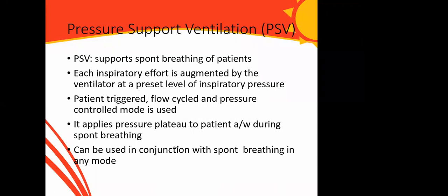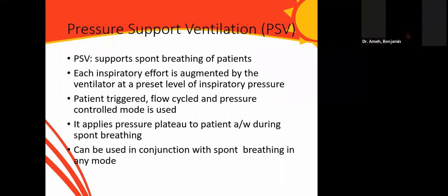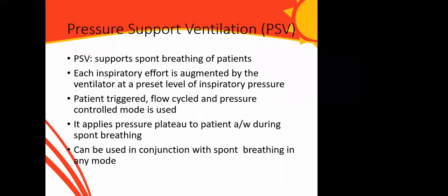Thank you, sir. All right, so in pressure support ventilation, pressure is applied to the patient's airway during spontaneous breathing. And like I mentioned before, the pressure support can be used with any mode of ventilation.